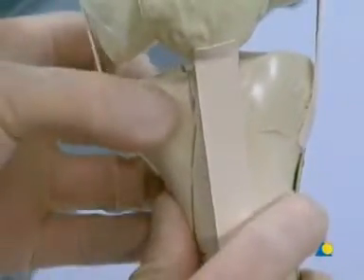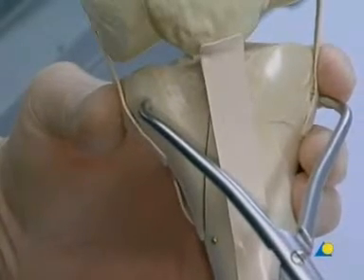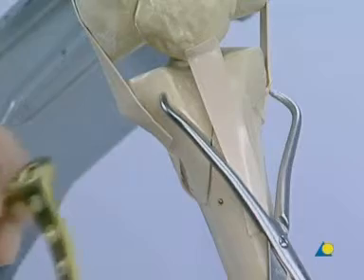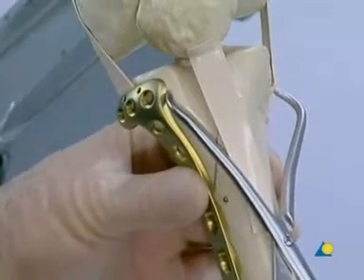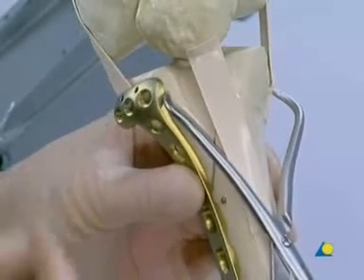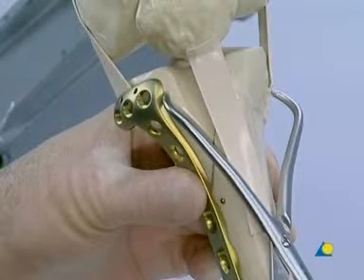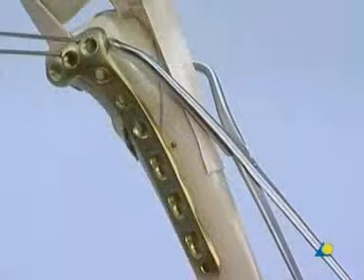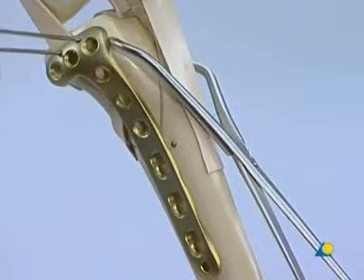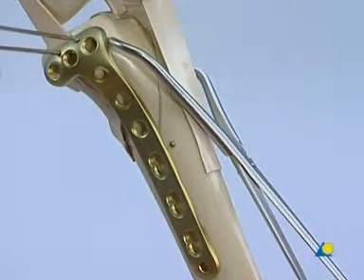After reducing the lateral construct, the reduction is held in place using the large pointed reduction forceps. A 4.5-5.0 LCP proximal tibial plate is placed to support the lateral condyle by buttressing it. Alternatively, either a T buttress plate or a tibial head buttress plate can be used. The LCP is fixed temporarily with two K-wires. Before placing any screws, it is advisable to check the quality of the reduction with X-rays in two planes.